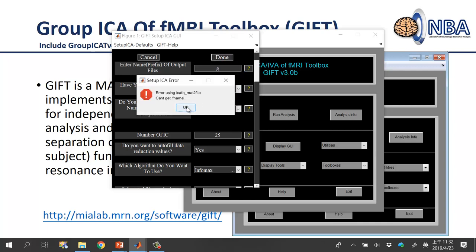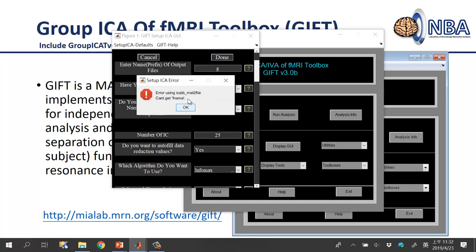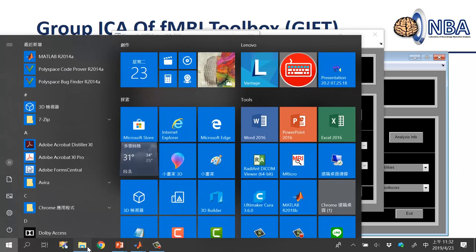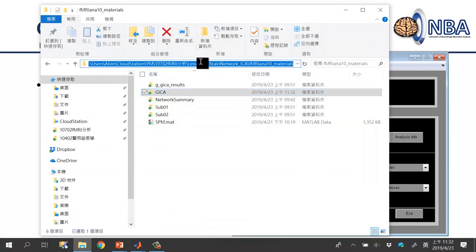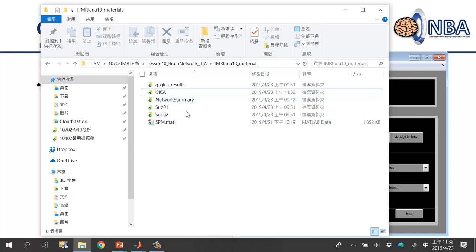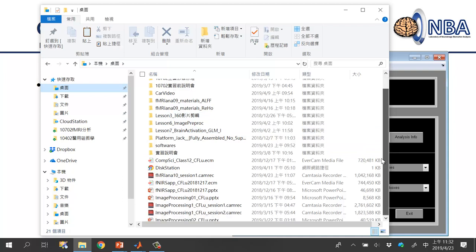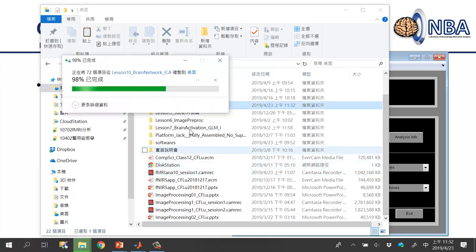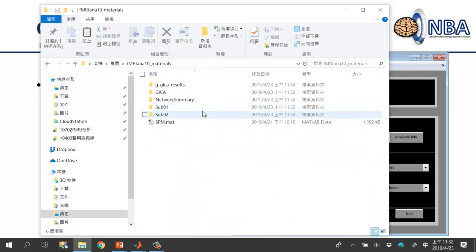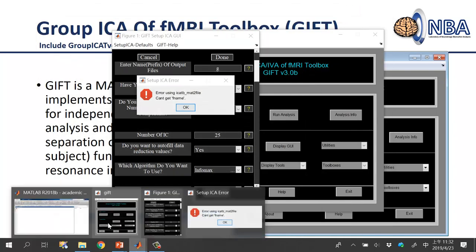If you see an error about file names containing Chinese characters, that's because your path includes non-ASCII characters. Copy all files to your desktop and avoid any Chinese characters in file paths, then redo the setup.